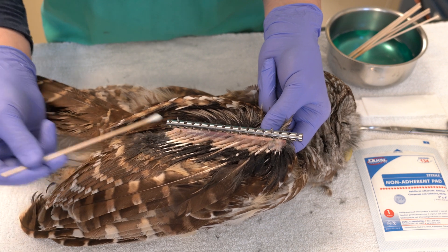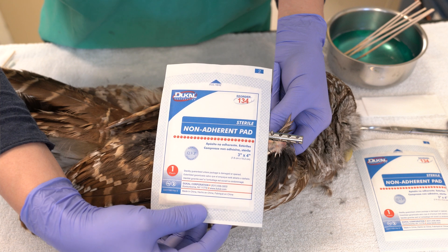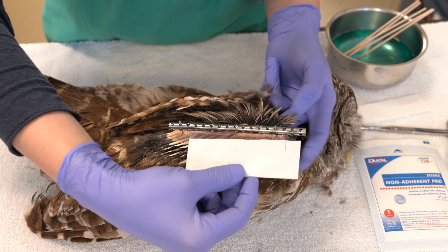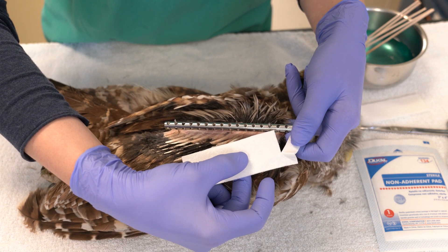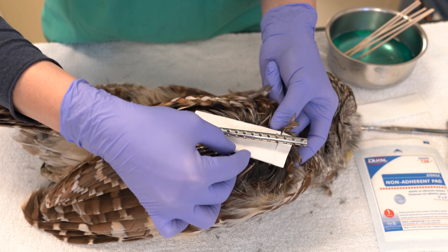After cleaning all of the surgical sites, a non-adherent bandage should be applied between the pins to protect the surgical site and absorb any further discharge to reduce tissue maceration. You can do this by cutting a small notch in each piece of bandaging material and sliding them under the external surgical bar.